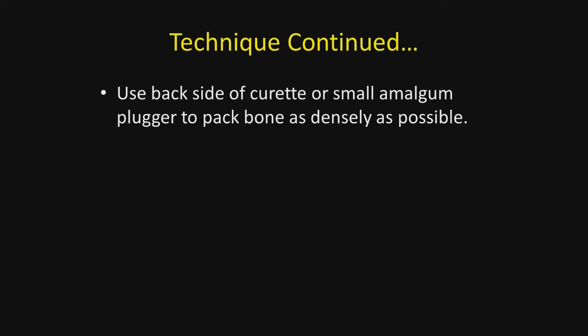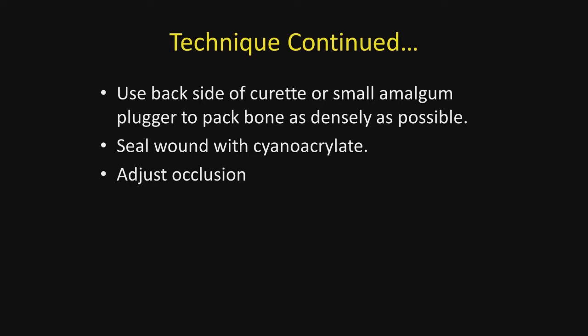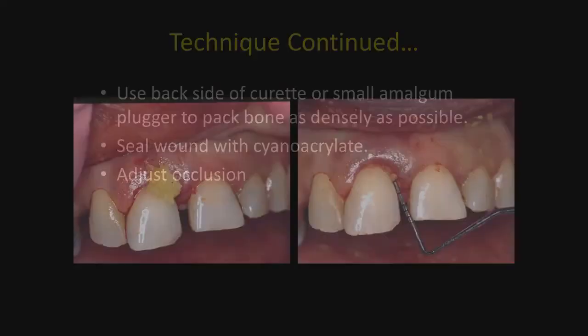Continuing, use the back side of the curette or a small amalgam plugger to pack bone as densely as possible. Seal with cyanoacrylate and be sure and adjust the occlusion, because many of these teeth are extruded and are in hyperocclusion, and once you tamp the bone material around there, the tooth is markedly stable and may interfere with occlusion. So you often need to adjust the opposing tooth and certainly the incisal edge, because the tooth will probably interfere in protrusive.